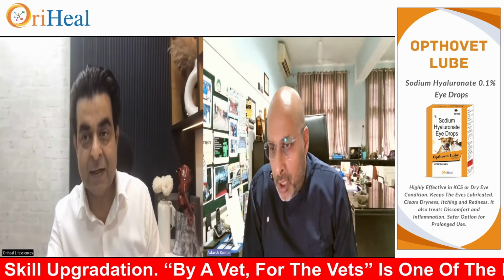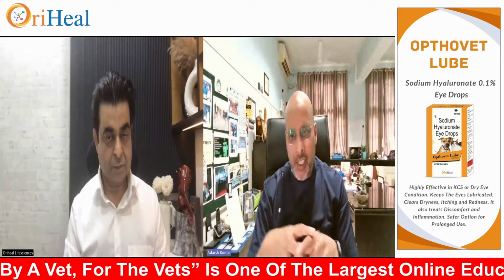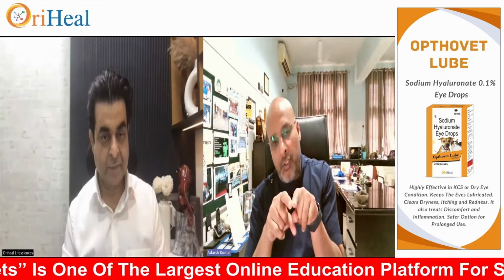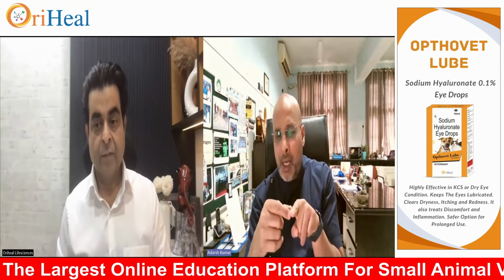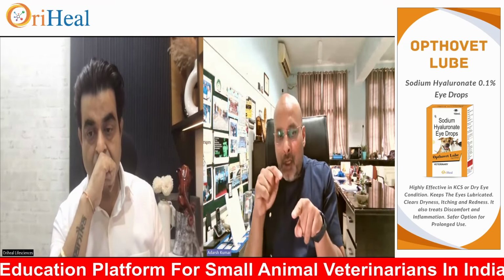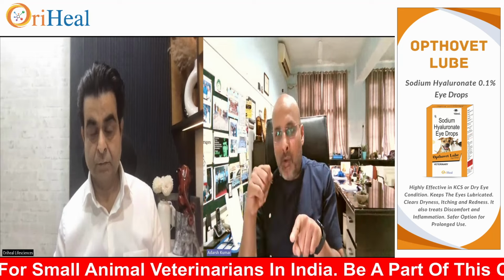Yeah, what are the possible complications of a retained tooth? See, if it is a retained tooth, mostly it is a deciduous tooth. So the root of the deciduous tooth impinges upon the root of the permanent tooth, right? If it is a small breed, it doesn't matter, but with the passage of time, once the wear and tear or attrition of the tooth starts, this root impinges upon the root of the permanent tooth and can cause injury and can loosen the tooth. Okay, so it has to be removed.